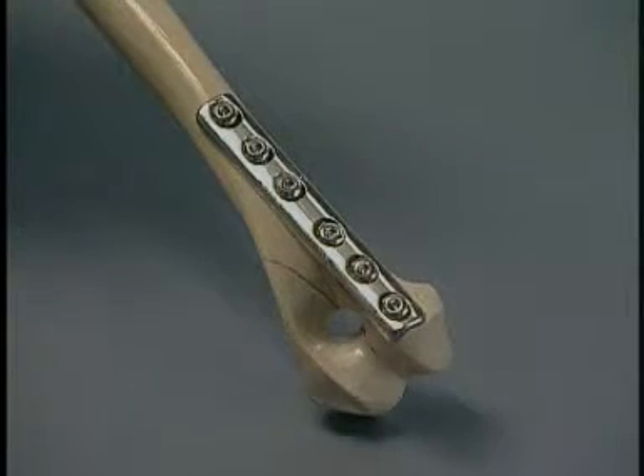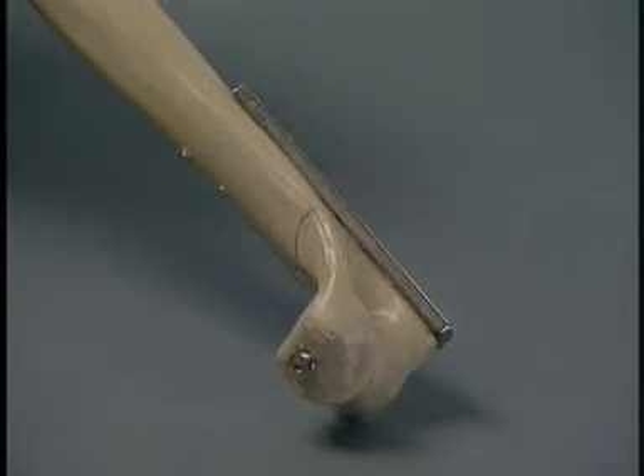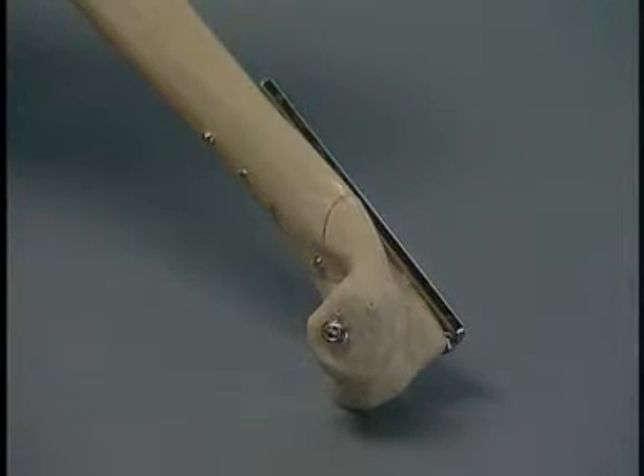All of the remaining screws have been inserted. The plate needs minimal contouring when placed on the caudal ridge of the medial portion of the humeral condyle. Care must be taken when positioning the plate here, so that it does not interfere with the proximal ulna during extension of the elbow.